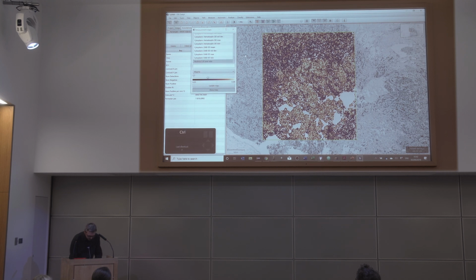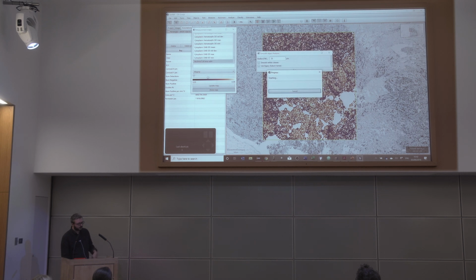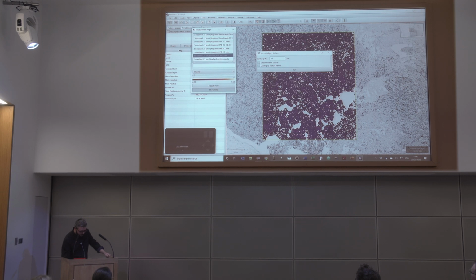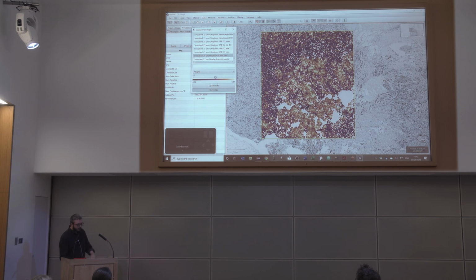So I'm going to go to the shortcut. I'm going to add in some additional features for every cell. So we've got our 40 measurements or so, and now for each cell, I have supplemented these with smooth measurements. So essentially, I've calculated a weighted sum of the corresponding measurements for neighbors and calculated the local cell density and so on as well. We could calculate different additional features like textures or whatever else we might need, but this is a simple and quite fast method to get.